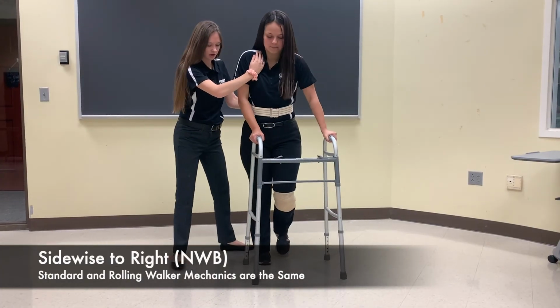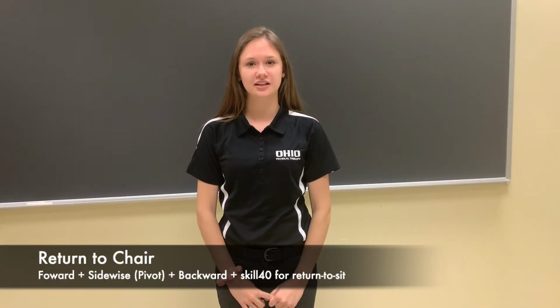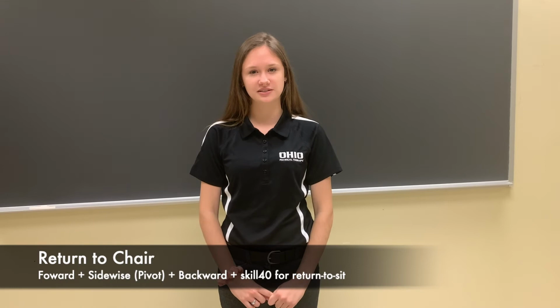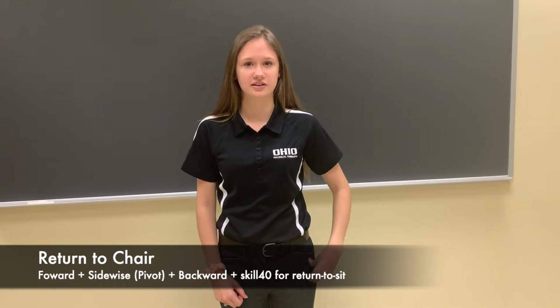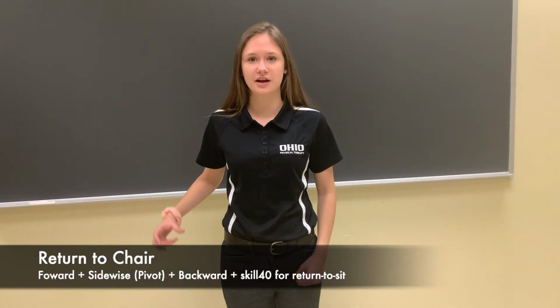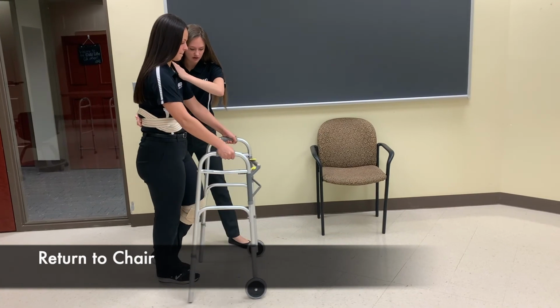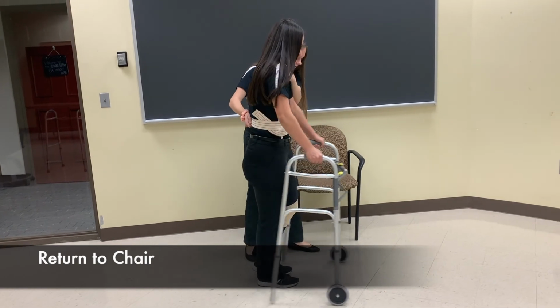To return to sitting, the patient should first use forward ambulation to arrive at the chair, and then use a combination of sidewise ambulation via pivoting on their unaffected limb and backwards ambulation until they reach the chair and can feel the chair on the back of their legs. They should then reach back for the chair with their arms, and you can refer to Skill 40 for proper sitting technique.